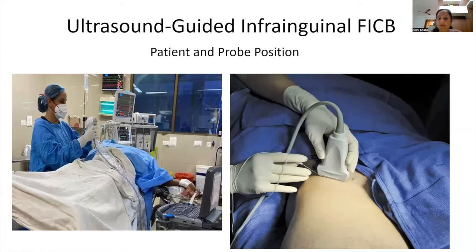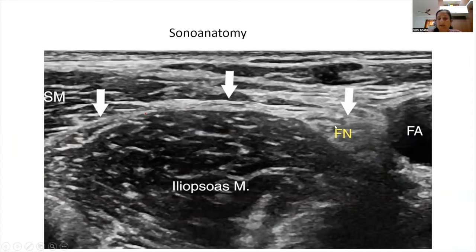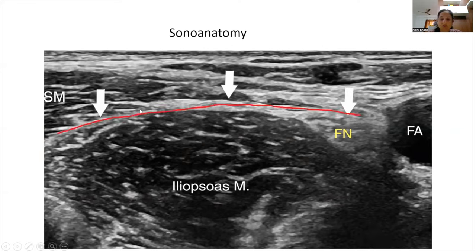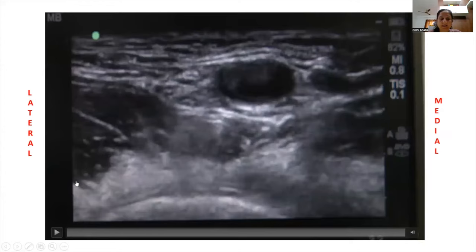With the probe placed just below the inguinal crease transversely, the sonoanatomy shows — from medial to lateral — the femoral vessels. Using the VAN mnemonic: femoral vein, femoral artery, and just lateral to the artery is the hyperechoic femoral nerve, sandwiched between the artery and the belly of the iliopsoas muscle. Above the iliopsoas is the fascia iliaca — our plane of interest — and above this the sartorius muscle. The needle enters from lateral to medial, targeting the plane between the iliopsoas and sartorius.